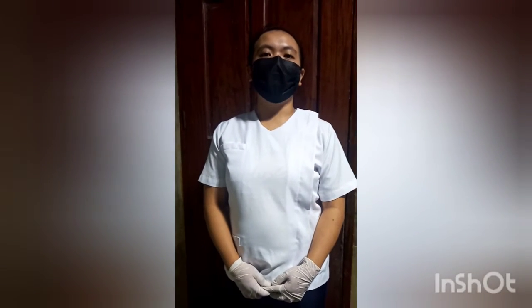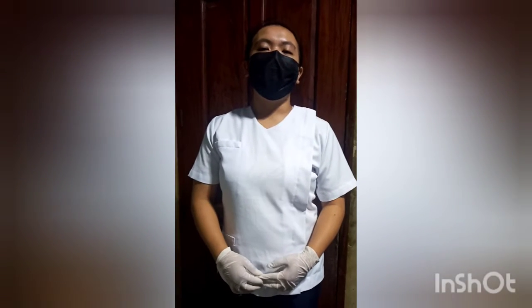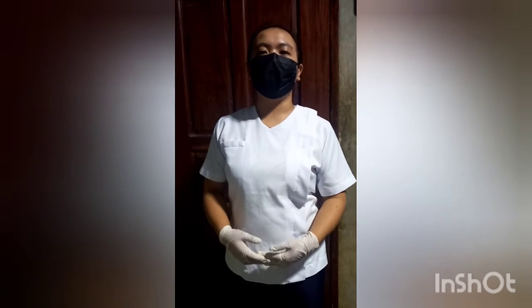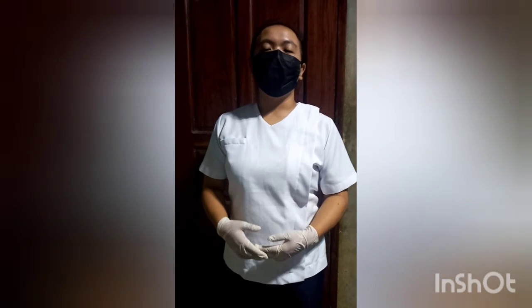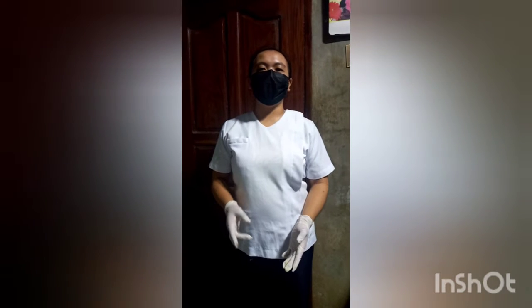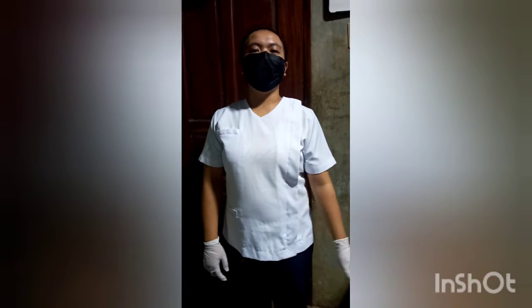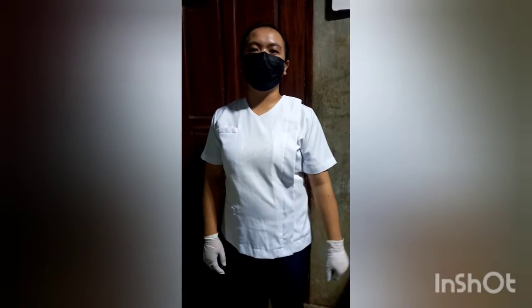Tell the patient that the test records the heart's electrical activity and it may be repeated at certain intervals. Then emphasize that no electrical current will enter his or her body. Tell the patient that the test typically takes about 5 minutes. Then lastly, ask the patient about allergies to adhesive as appropriate.